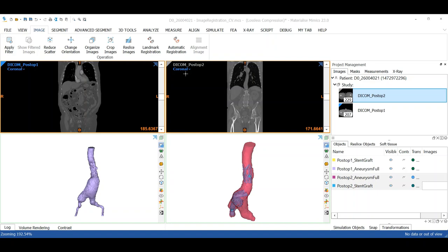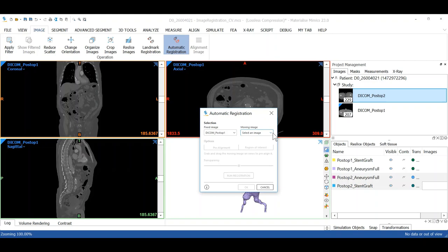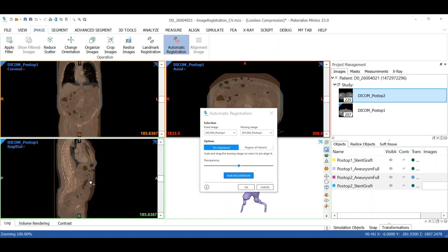we are able to overlay the two set of images and align them together using our drag button here and just have them try to match as best as possible.